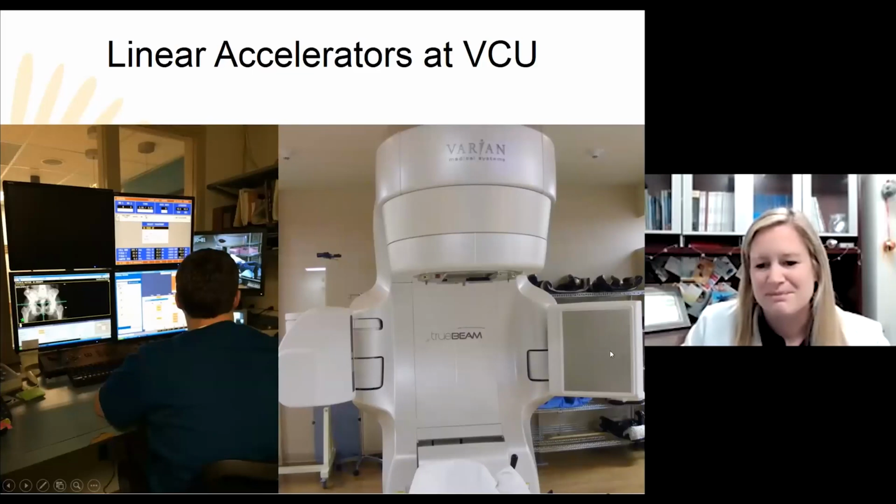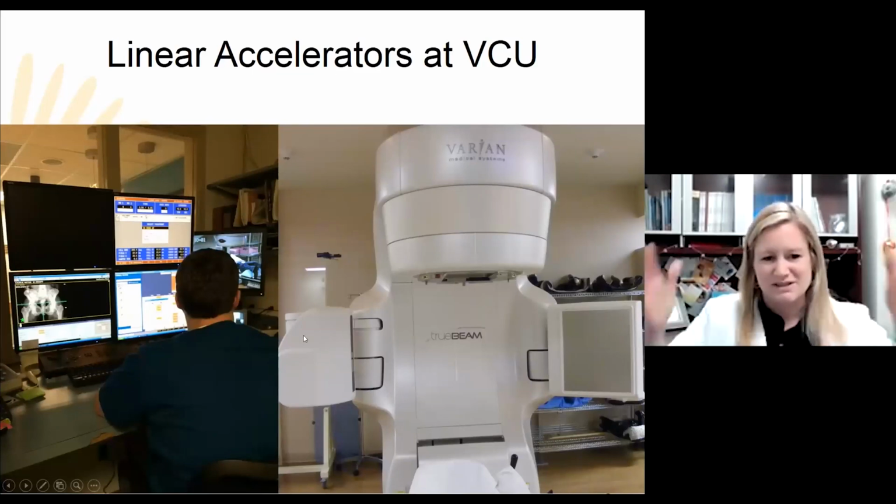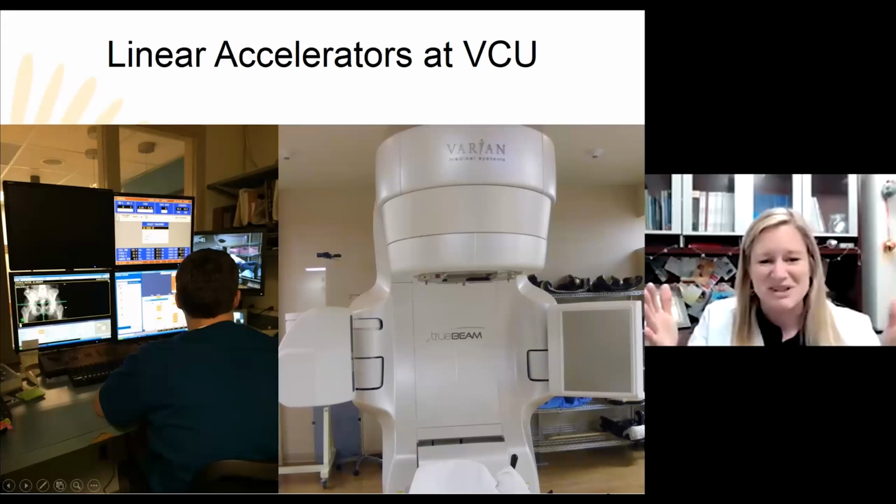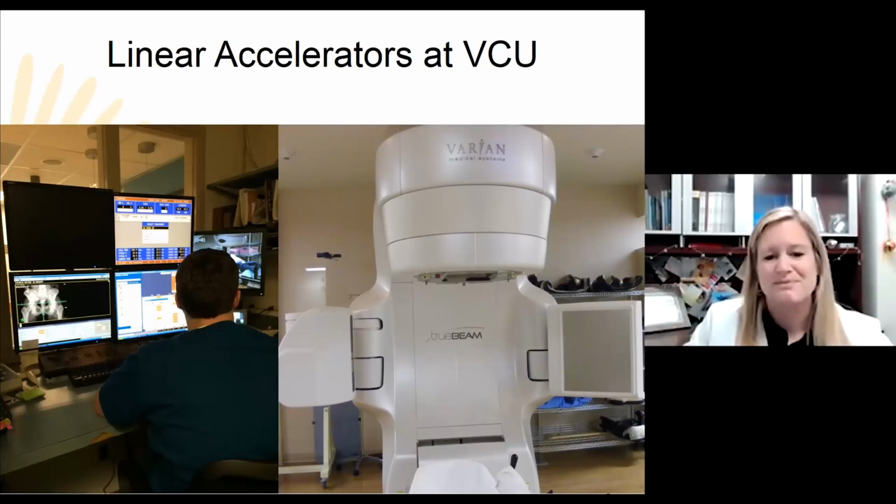These arms that are sort of on the sides, those are what are actually taking the pictures. So they're similarly x-rays, but they're not quite as high energy. So we can actually take really good x-rays and CAT scans before we turn on the treatment, depending on what we're looking for. And then this is what it looks like outside of the room on the left. So again, we can see and hear you on the cameras, and we're taking x-rays to set you up. And these are run by our therapists.